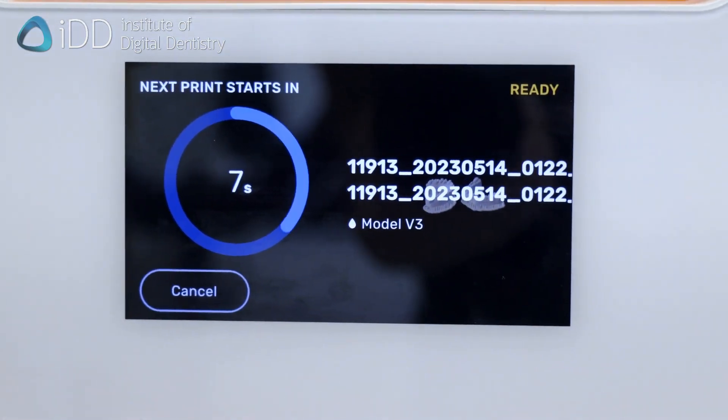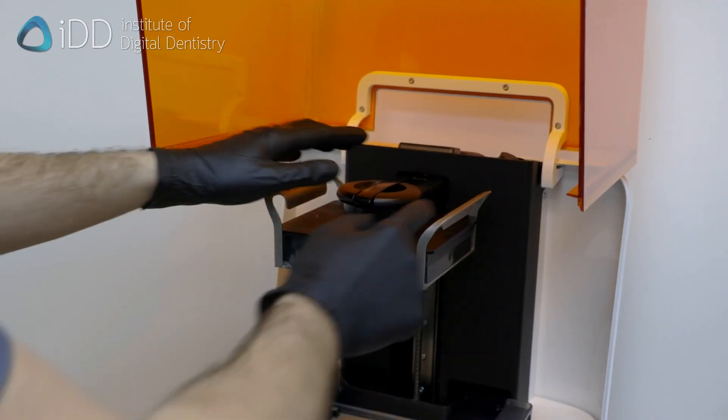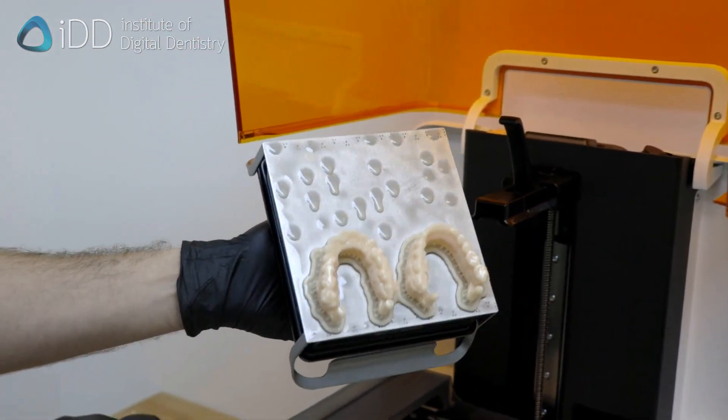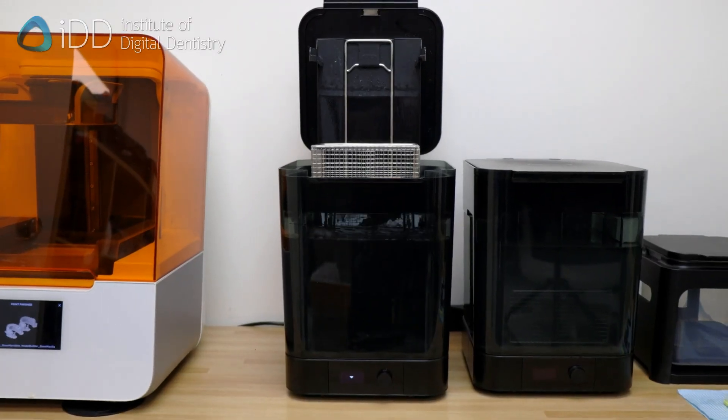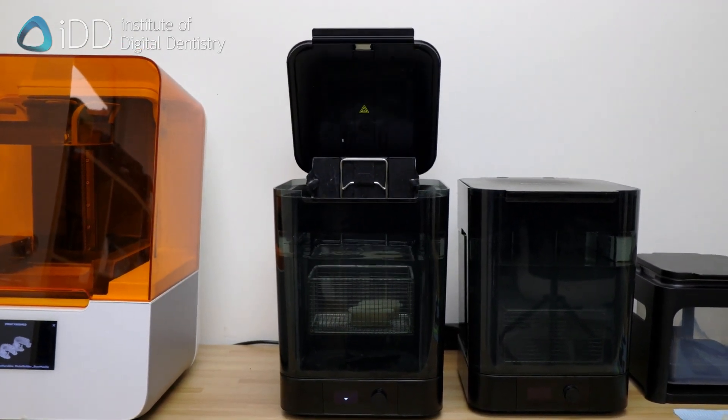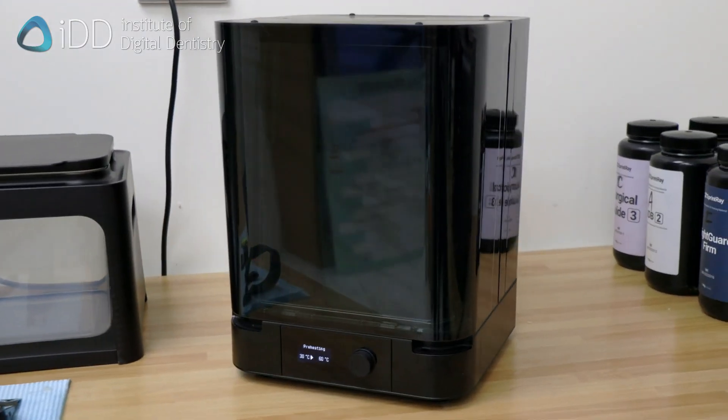Now initiate the printing process. Once done, the model is removed from the printer platform for post-processing. The model is then washed in 99% isopropyl alcohol twice and then cured. Here we are using the Formcure.